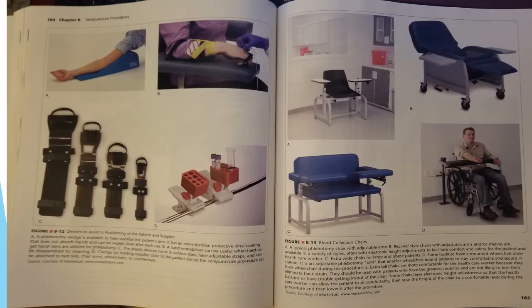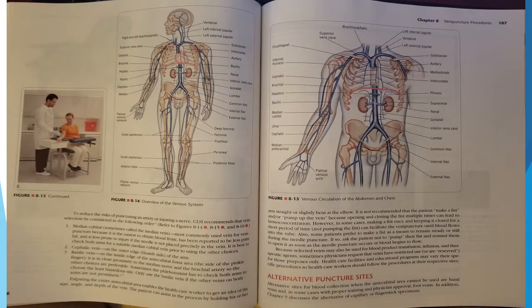Pages 184 and 185 show various tools and things that are used for blood collection. To reduce the risk of puncturing an artery or injuring a nerve, CLSI recommends that vein selection be considered in the following order. Refer to figures 8-14, 8-15, and 8-16.